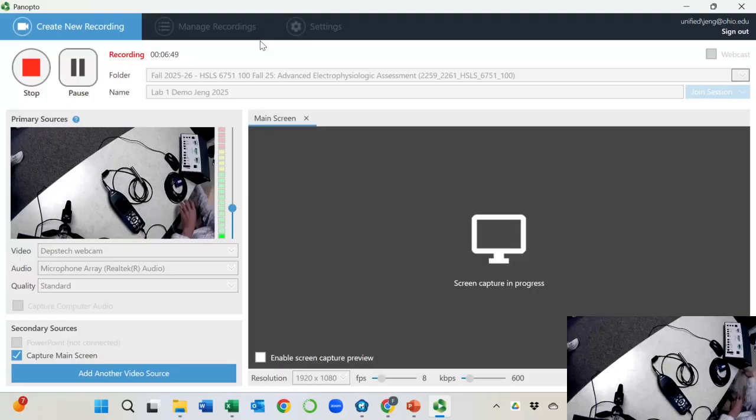Okay, and this is the insert earphone. As you see, I am a naughty boy. Whenever I get something, I tear it apart and then try to put it back together, obviously without success. All the transducers in my lab have been modified for my purposes, and this is no exception. But when I was doing the modification, I probably did something wrong. The output was intermittent. I must have done something wrong, but I couldn't figure out where. So I don't use it for research.